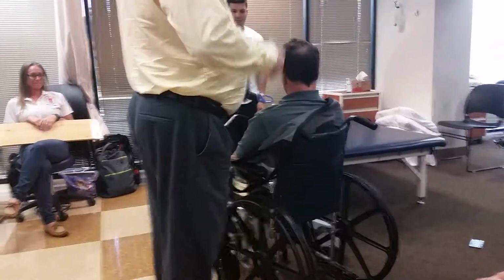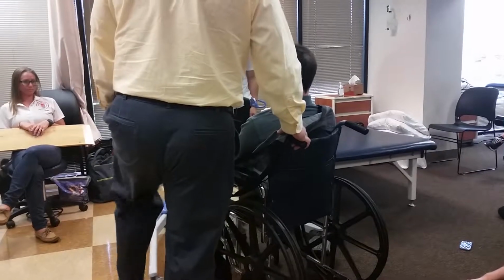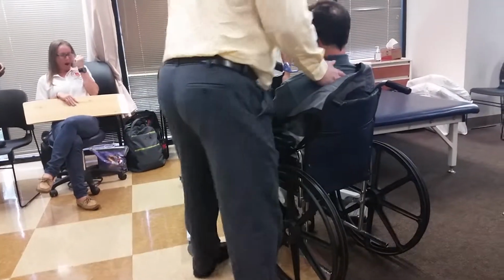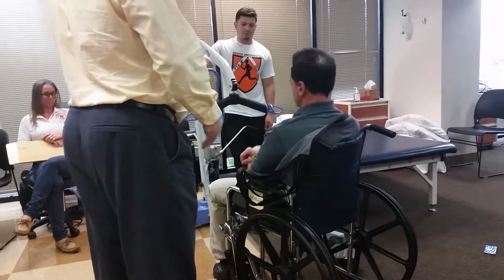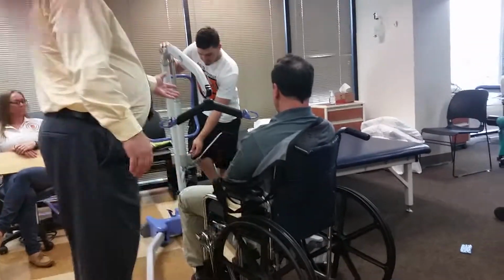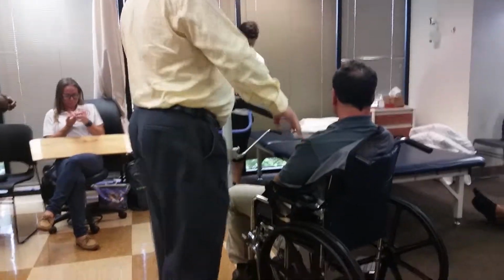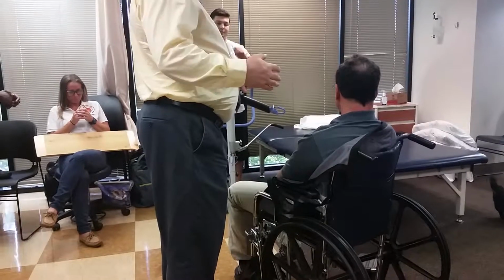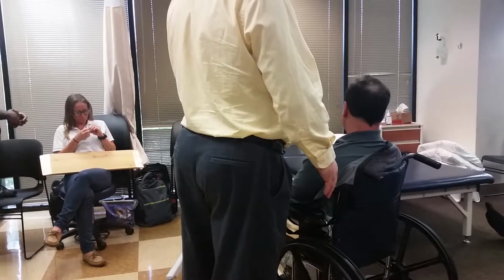And then he sits in the chair for 3 hours. He has lunch, he talks to his family, he's building up his sitting endurance, his lungs have changed position, he could try and kick his knees out, so he's trying to get some quad working. He could try and put his feet on the ground and just lean forward, engage his abs. So there's so much you can do now from the sitting position. But the purpose of using this, it's like a human crane, because instead of trying to move people my size or even Kevin's size, who can't use their muscles to assist, you're going to hurt your back. Maybe not the first time, maybe not 2 months later, but eventually you're going to hurt yourself.